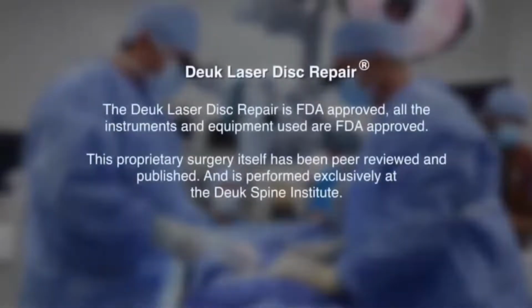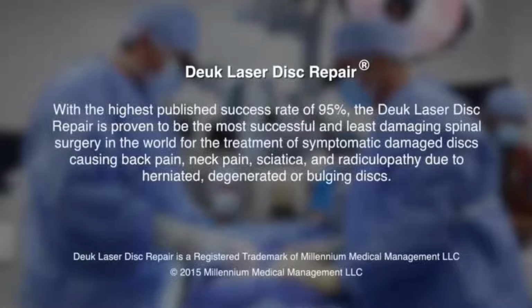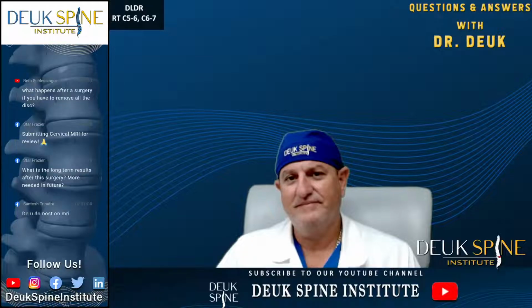The Deuk laser disc repair is FDA approved. All the instruments and equipment used are FDA approved. This proprietary surgery itself has been peer-reviewed and published and is performed exclusively at the Deuk Spine Institute. With the highest published success rate of 95%, the Deuk laser disc repair is proven to be the most successful.